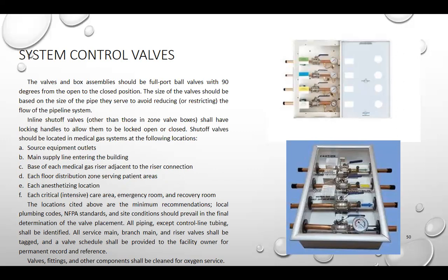Inline shutoff valves, other than those in valve boxes, shall have locking handles to allow them to be locked open and closed. Inline shutoff valves should be located in the medical gas system at the following locations. A. Source equipment outlet. B. Main supply line entering the building. C. Base of each medical gas riser adjacent to the riser connection.